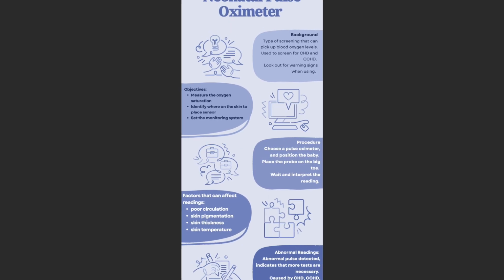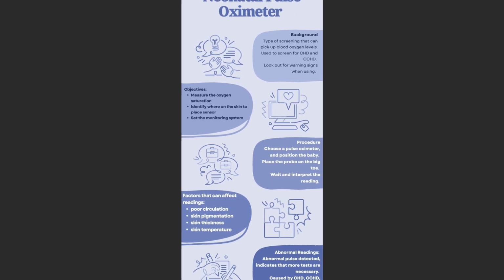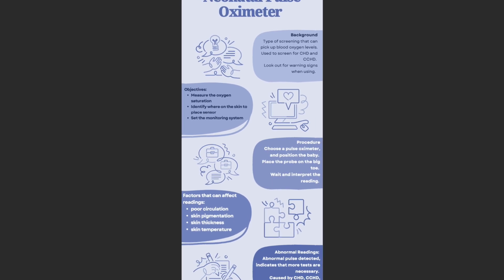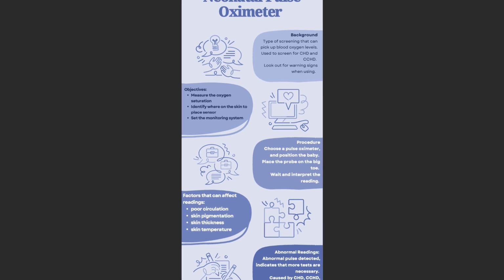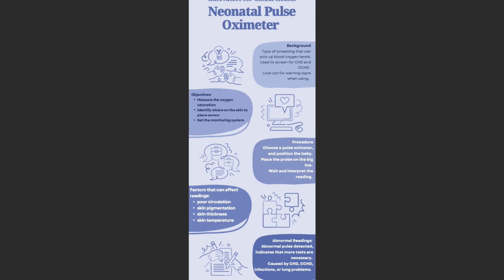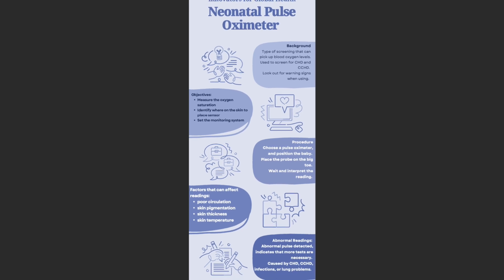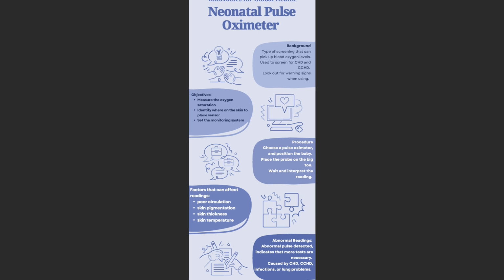This type of screening is very time-sensitive because of the implications of being diagnosed with CHD or CCHD. A normal pulse oximetry screening result does not definitively rule out the presence of CHD or CCHD. Therefore, hospital staff should remain vigilant for any warning signs in the infant. However, if the newborn fails the screening, a follow-up is necessary.